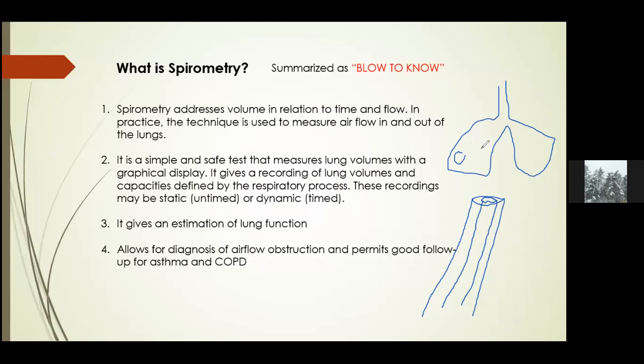For that reason, even for a person who is not able to expand their lungs, you can also use spirometry to determine whether they have a problem with expansion. When the problem is expansion of the chest or the lungs, then this person is restricted in breathing because the amount of air that they can take is restricted by the expansion of that lung. So in that kind of pulmonary disease, we say that you have a restrictive pulmonary disease.